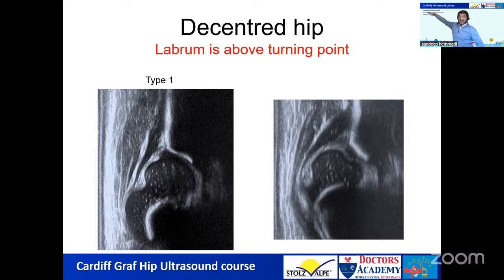If I put my hand here, then the balloon with helium is going to rise up or go up this way, and it will dislocate. So at this extreme, it's easy to decide that's a dislocated hip or a decentered hip or a balloon which is not being contained. And at this end, it's easy. But when I'm somewhere here, that's when you need a system to tell you when a hip is centered and decentered. And that's why the measurements and the other parts of this system help you to consistently make the right diagnosis.